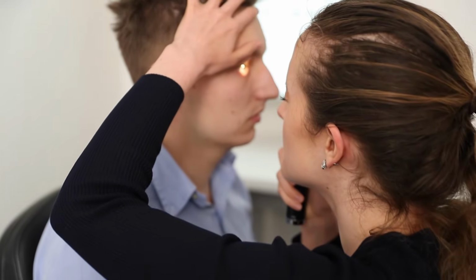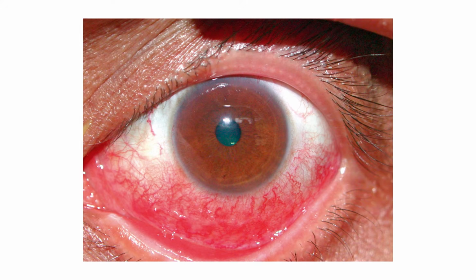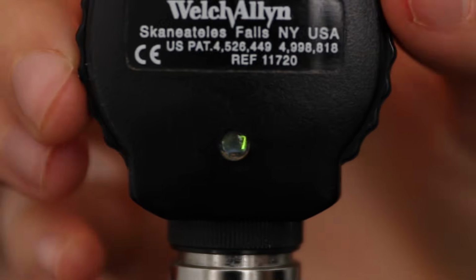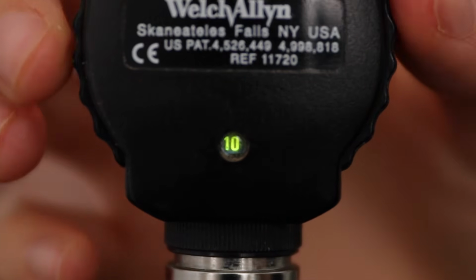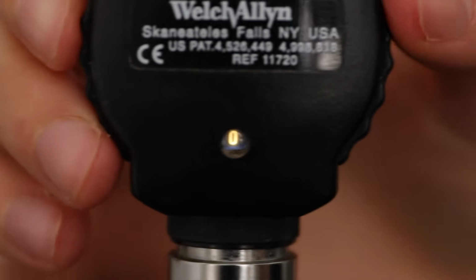To examine the anterior segment, move into about 15 centimeters from the patient, still at a 15-degree angle, and gently place your offhand on the patient's forehead for stability. Examine the anterior part of the eye for things like conjunctival injection and corneal opacities. You'll need to dial up a plus lens to around 10 diopters to get a clear view here. Now dial the lens back to 0 to perform the 4-step fundus examination.